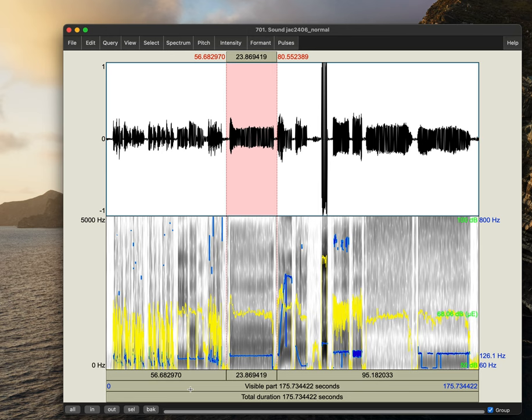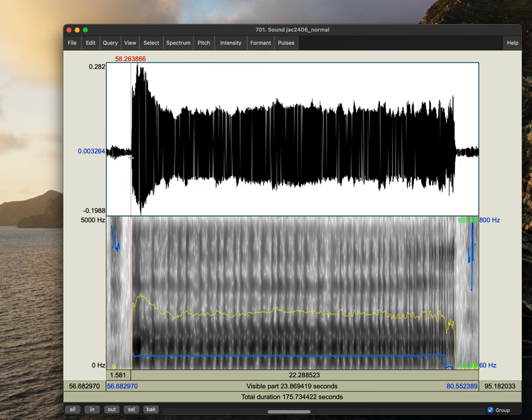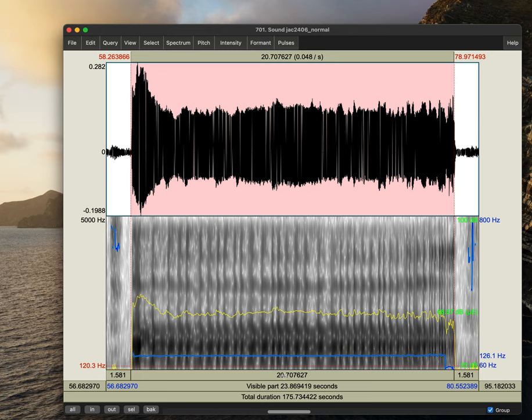So if I was to look at maximum phonation time, we see that here. I'll zoom in. And we can see that the maximum phonation time began here and ended right here. And so this tells us immediately that our maximum phonation time was 20.7 seconds.